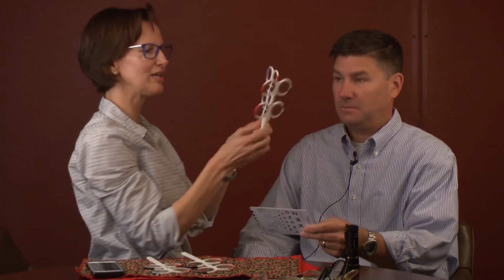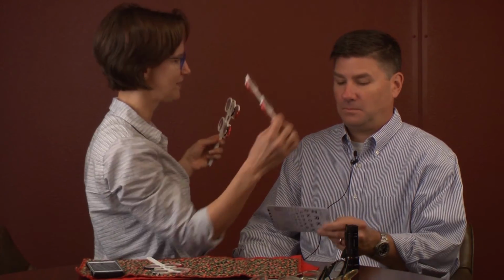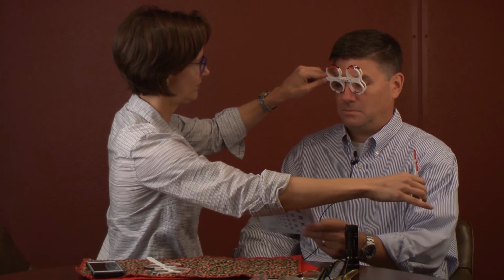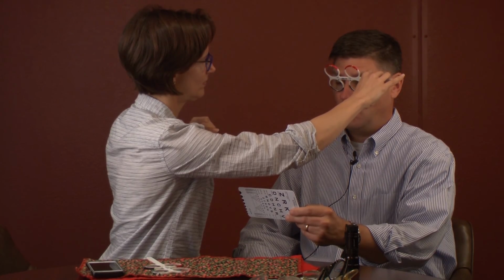And then you can kind of keep that together. So I'm adding the 0.5 to the +2. That gives me a 2.5. And if I've had time, I'll compare. Now I've got a 2.5 and the 2. We'll see which one's better. Compare 1 with 2. 1. So +2 is where we land.